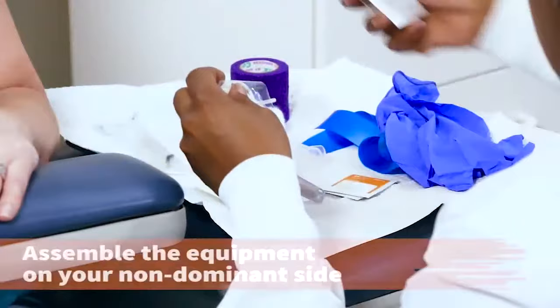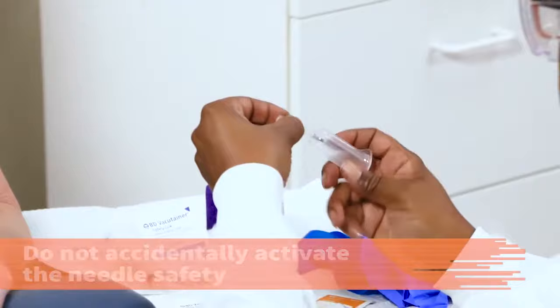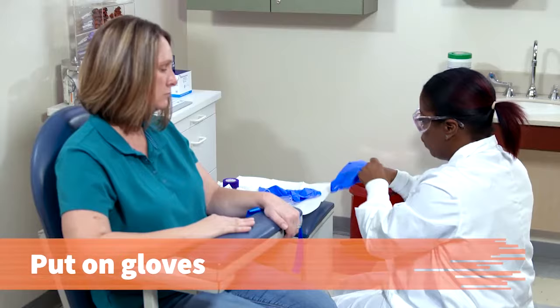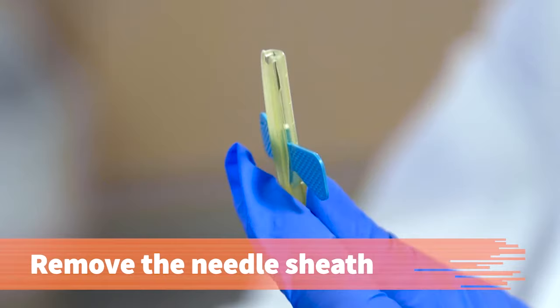Assemble your equipment and supplies on the non-dominant side of the patient's arm. Remove the butterfly device from the package and stretch the tubing slightly. Take care not to activate the needle retracting safety device accidentally. Attach the butterfly device firmly to the vacuum tube holder using the sheathed needle at the end of the tubing. Put on disposable gloves. Reapply the tourniquet when the alcohol is dry. Hold the butterfly wings pinched between the thumb of your dominant hand and index finger, or hold the base of the needle. Remove the needle sheath.